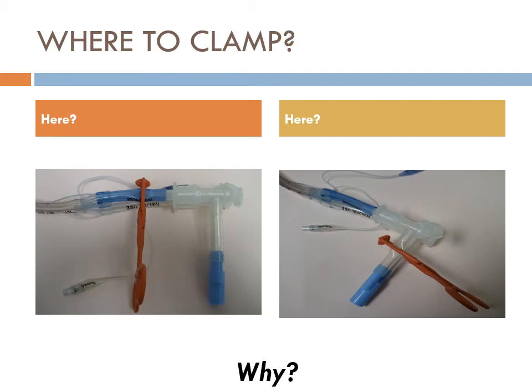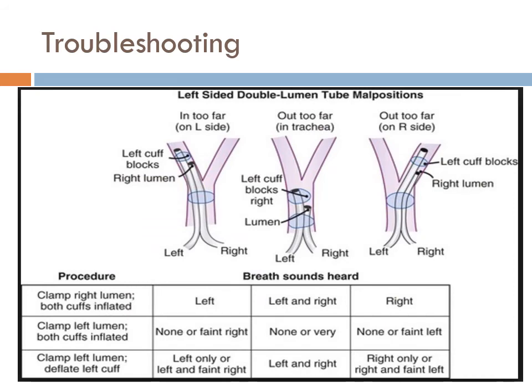Okay? If I had kept this closed, they would have been like, hey, this lung's still up. You'd probably look on their screen if it's a video, you can see it's not moving with your ventilation, but there's tons of air in there. It's because you left your port closed. So there's so many ways we can ask questions with this stuff. If you guys want to look at it again afterwards, I highly recommend you look at it again.